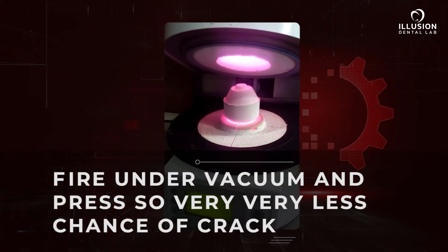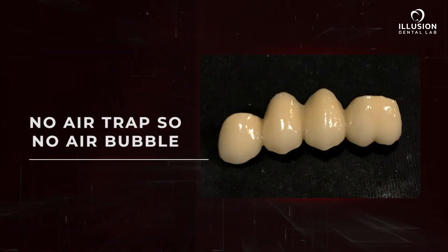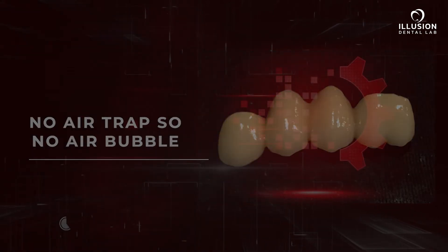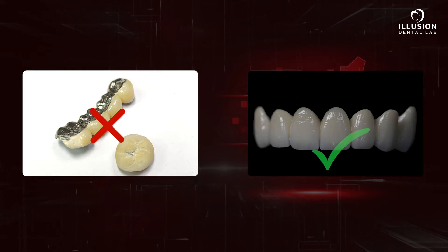The press technology eliminates the need for multiple firing cycles and also erases the chance of any air bubbles. The homogenous ingots ensure that the translucency is superior to the inaccuracies of a traditional build-up. The advantages are endless.